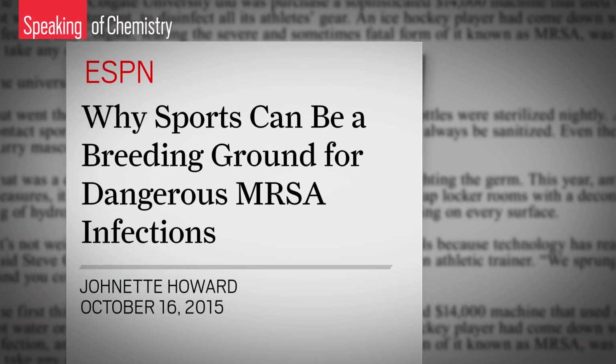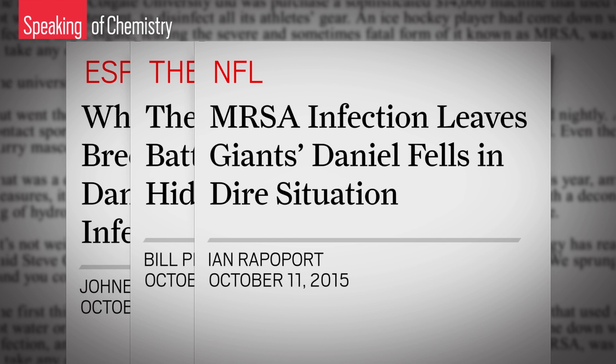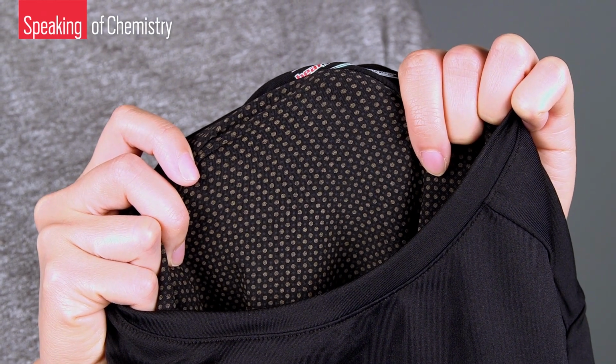So far, we've seen petri dish and animal studies with these electric bandages. But what about its effectiveness in people? Soon, a clinical trial at the San Antonio Military Medical Center will test the product's efficacy at treating patient burns. But doctors are already using the product to try to fight antibiotic-resistant infections, particularly in sports medicine. The bandage makers think their product could also help athletes' performance and have incorporated the silver and zinc pattern into sportswear. Vomaris is conducting studies of the shirts with endurance athletes.